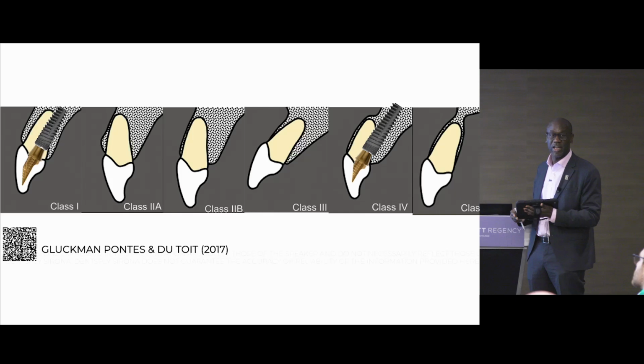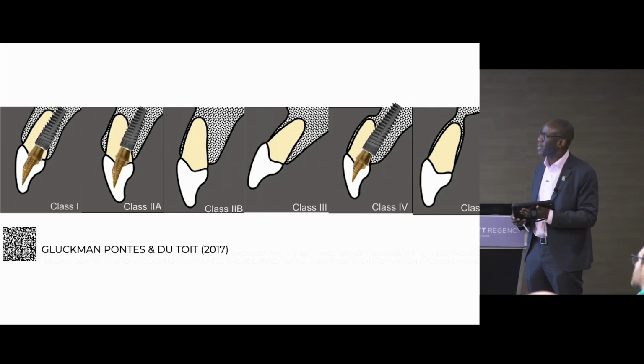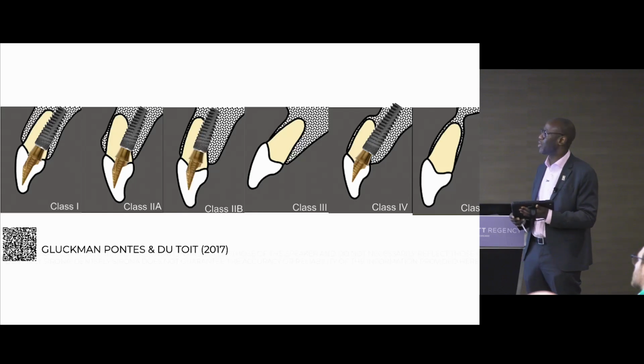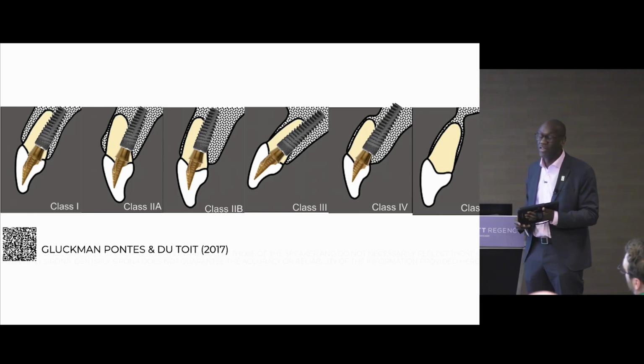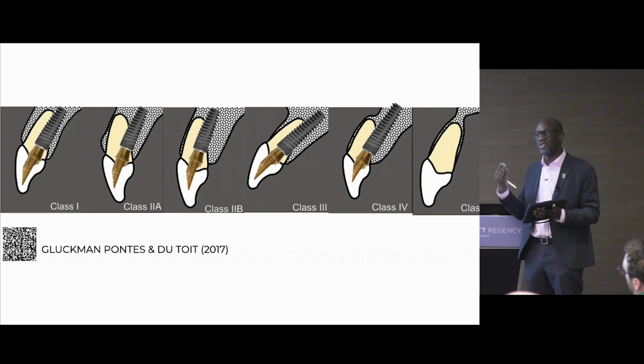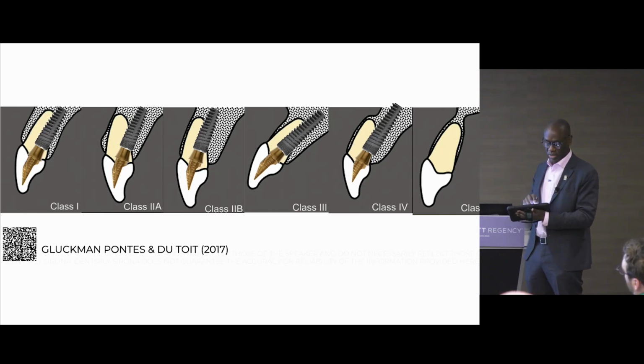And again, we can have palatal screw access. Again, there, taller angle cut, palatal screw access. We can also vary the placement according to the collar height. There, again, we can place it. And again, one of the most radical is there, which would have been incredibly difficult to place that implant immediately in a position where we would be able to use a normal tie base. So you can see how it fits into a particular pattern as to how we're going to do that.